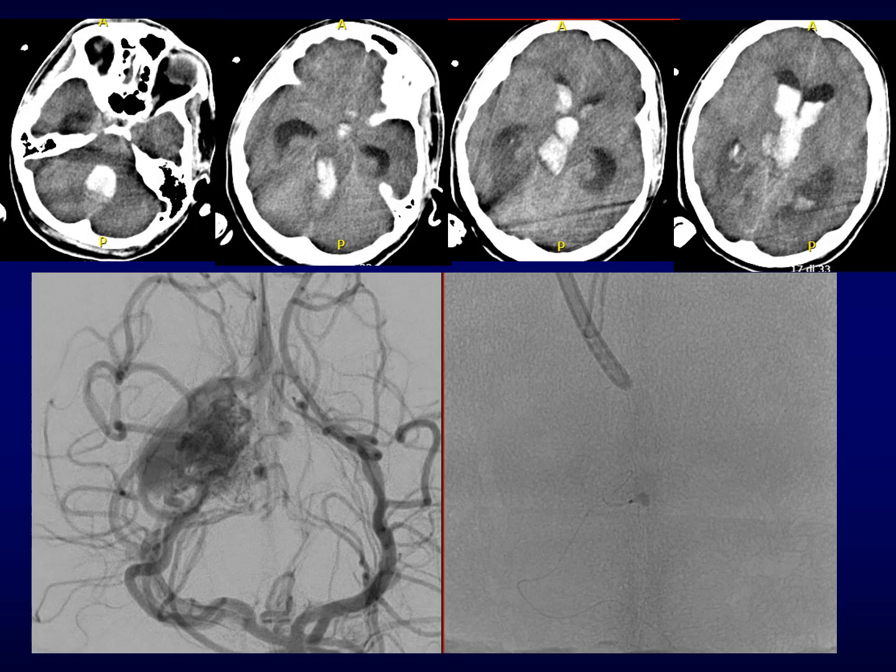A few more examples. This is a hemorrhage in a young person with, again, you can see in the posterior circulation a small central pseudoaneurysm in the mesencephalon, and you can see also here the microcatheter, which is arriving very close to the hole.